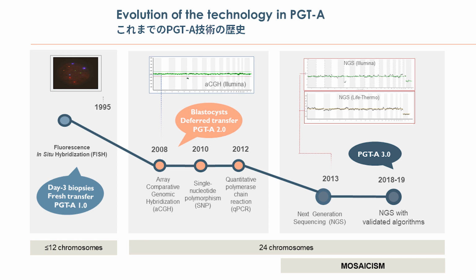And arrays were very successful for more than 5 years, but starting in 2013, 2015, next generation sequencing technologies appeared in our field, and then we were able to apply this technology. The most important platforms that appeared at this period of time were the platforms from Illumina and from Thermo Fisher. Both platforms really worked nicely. You need to understand the protocol you are working with. You need to understand the technology.